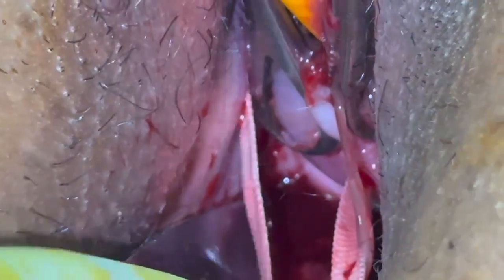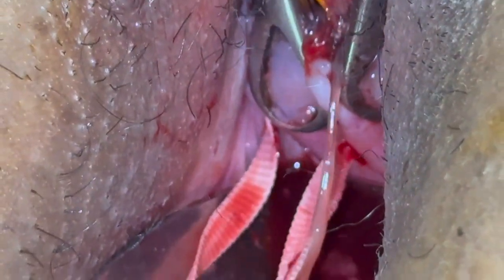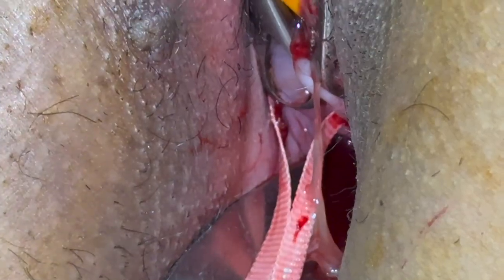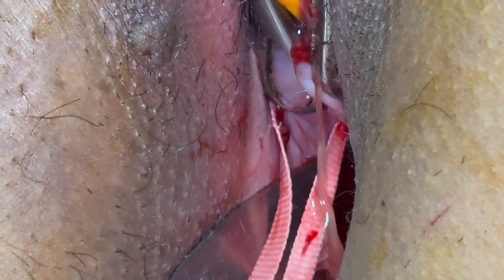Previously we used to bury this knot by incising the posterior vaginal mucosa, burying it and closing the vagina again. But the advantage of this procedure is that whenever the patient lands up in labor or is going into active abortion, we can just cut the stitch open and the patient can deliver or abort naturally.